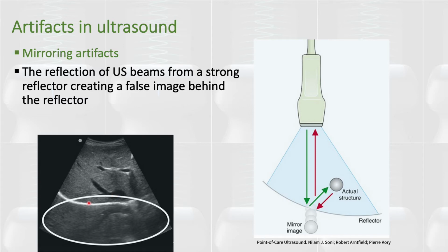So for example, here, this is the liver, this is the diaphragm, and you see this is part of the portal vein and hepatic veins, and you tend to see a reflection of the portal vein here. Now, it might seem like another liver, so to speak, beyond the diaphragm, but of course, this is a lung, and as we all know, it is the enemy of the ultrasound.